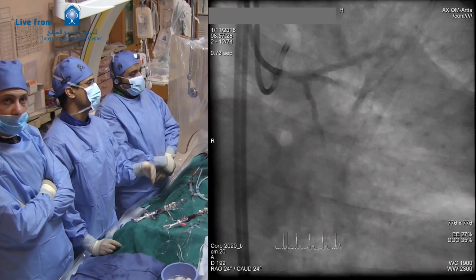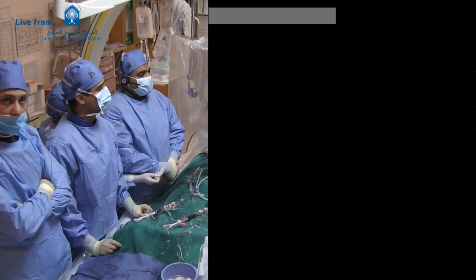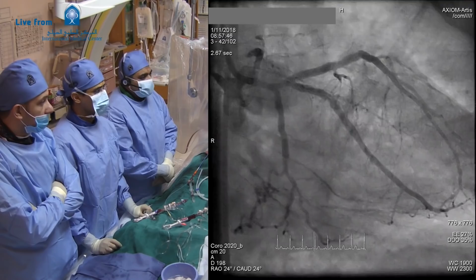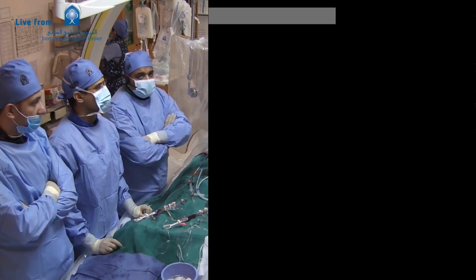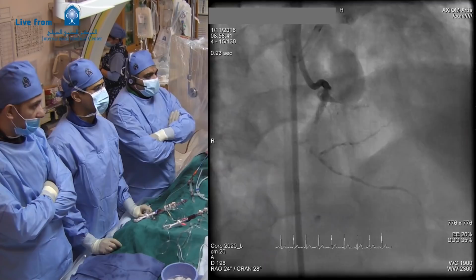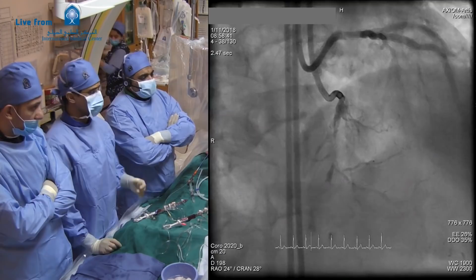So this is the first injection to the left system, checking out the previous work, patent stents. Next. And here you will see the occlusion from the proximal RCA till the crux, with some micro channels open here and there throughout the occluded segments. Next. So here the antegrade injection. And as you see here, again confirming the findings, there is occlusion also on the PDA, mid PDA. It can be the competitive flow from the PLV going to the PDA, or it can be a true total occlusion. Next.